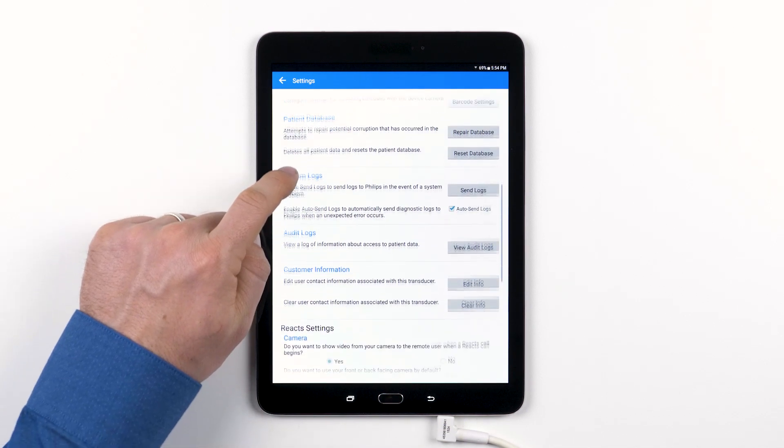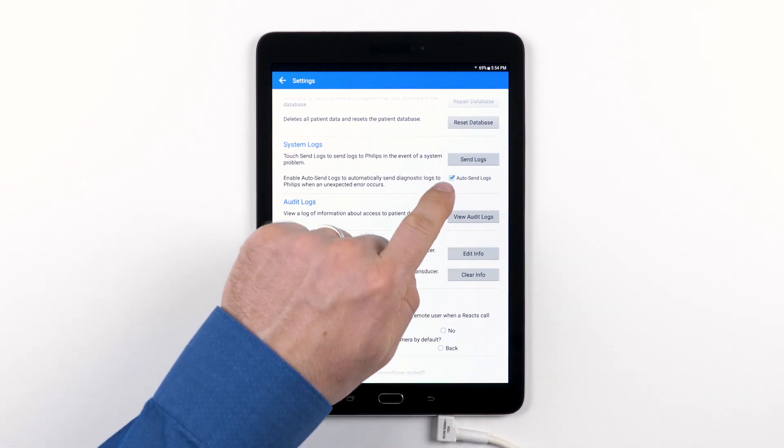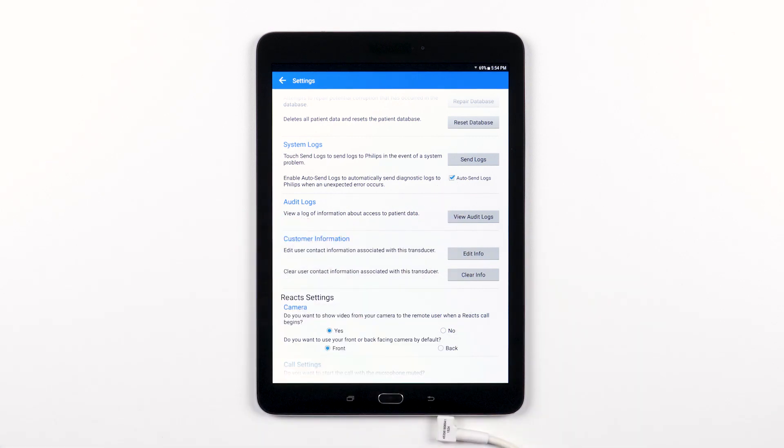The system allows you to send the system logs to Philips if there's a problem with your system. You also have the option to automatically send those logs by checking the box you see here.